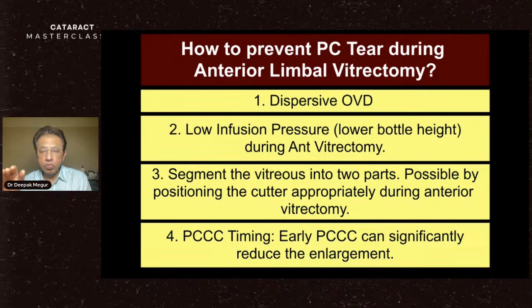My principle is to position it much more posterior to the posterior capsule and then segment the vitreous into two parts. Then we can definitely prevent the posterior capsular tear enlargement. And PCCC definitely does help us in preventing the enlargement. Whenever there is an opportunity, whenever there is a free edge, always do a PCCC.